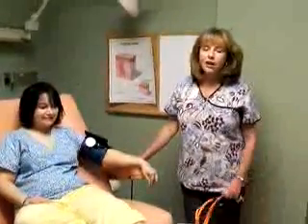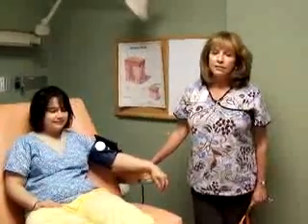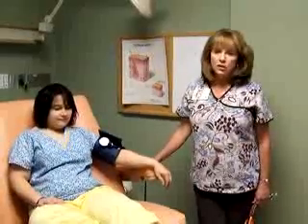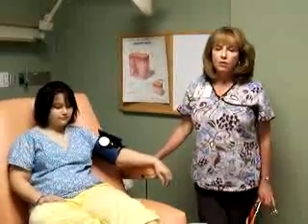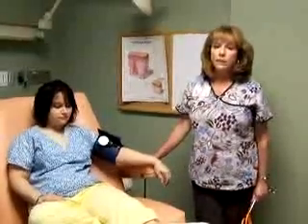Morning. We're here today to talk about the process of doing an ankle-brachial index. You would do an ankle-brachial index to establish the quality of arterial flow, especially in patients who have lower extremity wounds and who you are thinking about using compression on as a treatment.